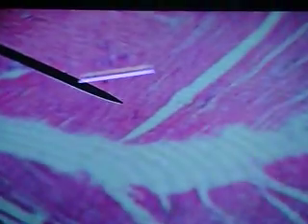So this is the undersurface of the tongue once again. Notice the absence of papillae, massive core of skeletal muscle. Let's go to a loop over here with this. Alright, all the various muscles here. And then you notice with the tongue, the muscles going in all different directions. These are branches of the lingual artery. So this is definitely the undersurface of the tongue.